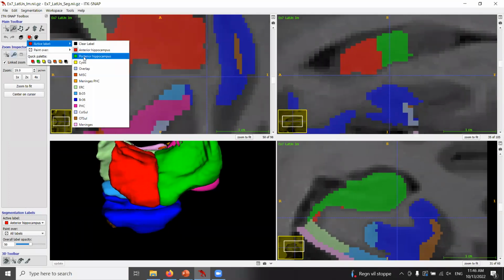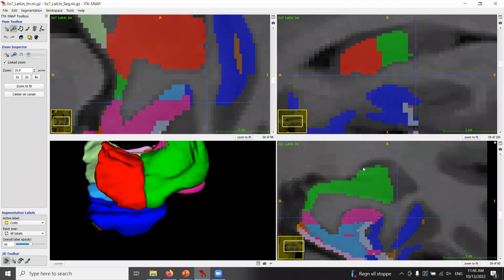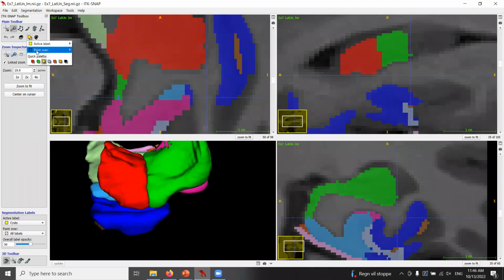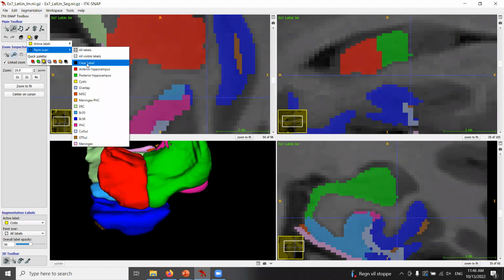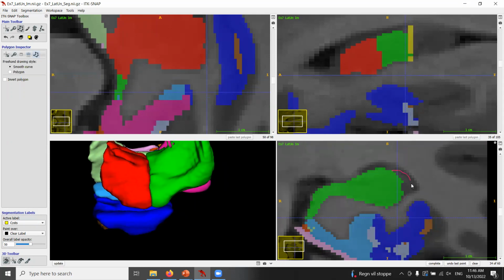And what I would maybe do here, and I'm just taking this yellow label because I don't think we're using it, is start the editing with another color. I would say only add labels where there's no label, so yellow over black. So what I would do is add the label on all the slices where it's missing.